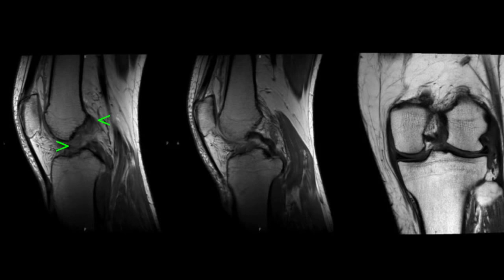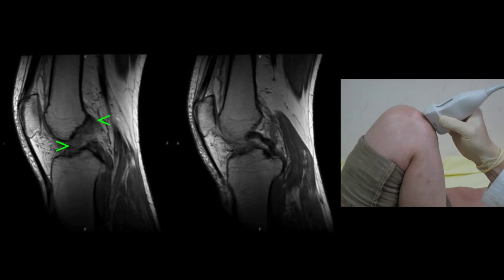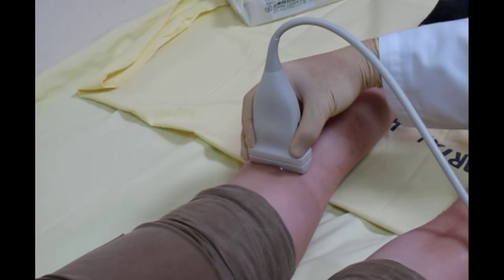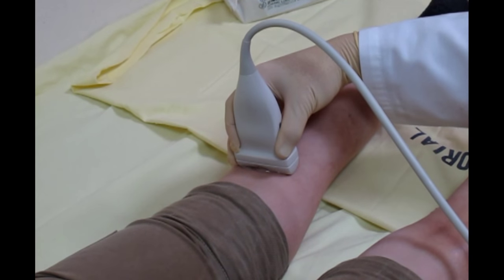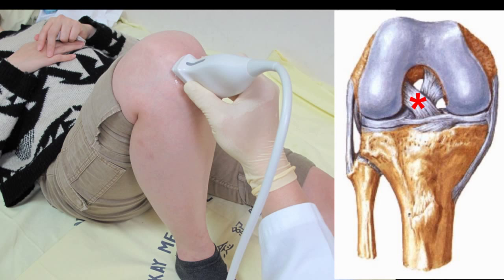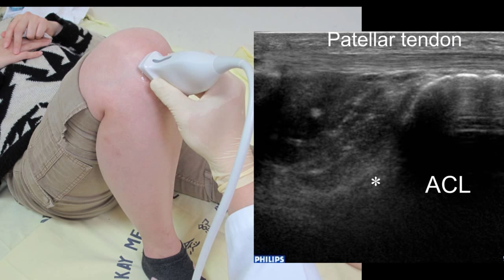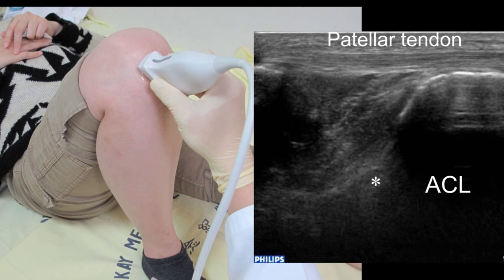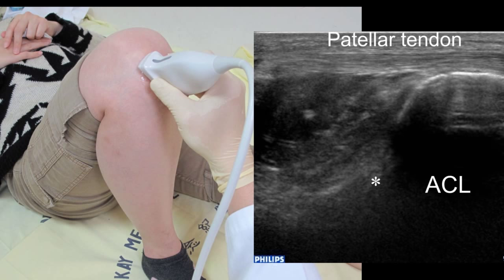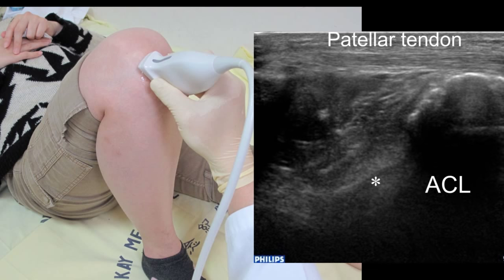Since the anterior cruciate ligament is deeply embedded in the joint, it is impossible to access the entire ligament by ultrasound. The ligament can be partially seen from the anterior side with extreme flexion of the knee, or evaluated by scanning the intercondylar fossa from the back of an extended knee to assess the associated hemarthrosis. Evaluation of the tibial portion of the anterior cruciate ligament can be performed from the anterior aspect of an extremely flexed knee, by placing the transducer on the patellar tendon and slightly rotating the proximal part of the transducer toward the medial border of the lateral femoral condyle.